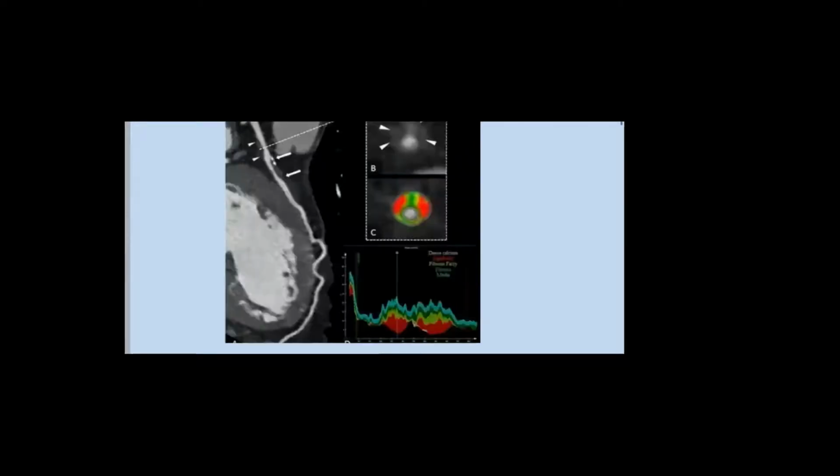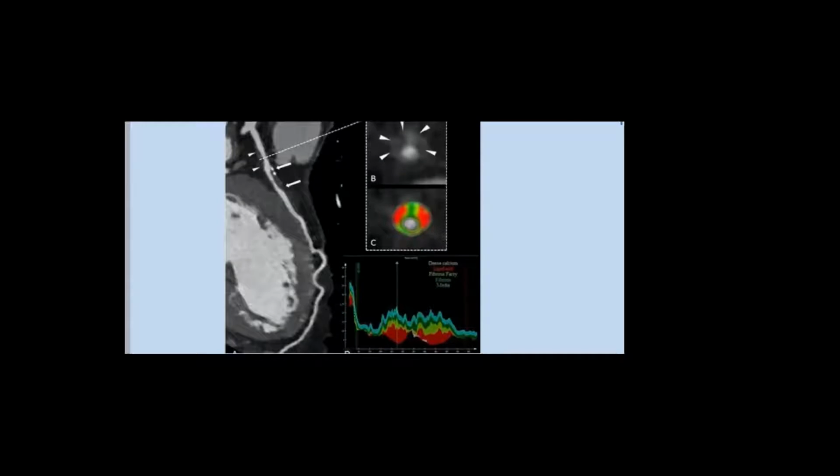Now, look at here. What do you think about this? Exactly. So what do you think about this LAD? The calcium scoring data? No, this is called multiplanar reformatting of the LAD. So the entire LAD is stretched out. You can see all of the LAD in its entirety.